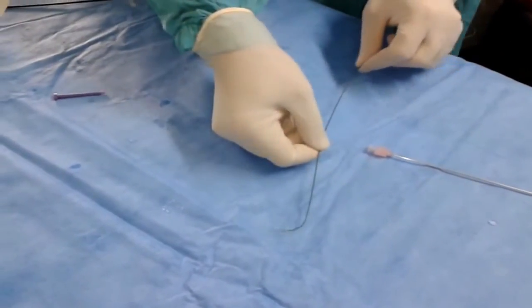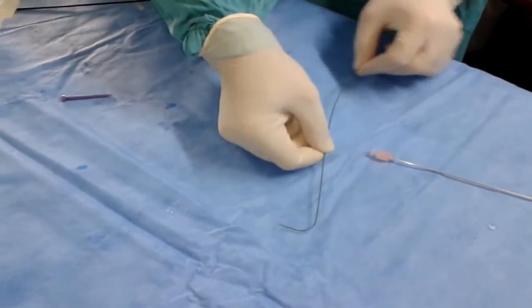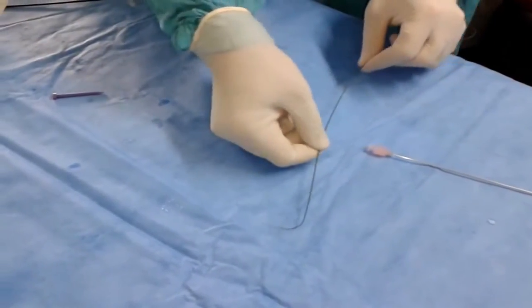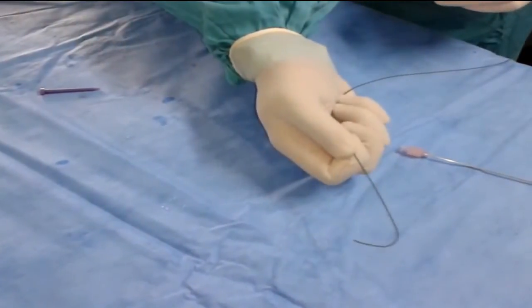The guide wire is firmly held between the index finger and thumb, 5–10 cm from the tip. The tip is straightened with traction on the body of the guide wire. With one hand, the other fingers apply traction on the body of the guide wire.